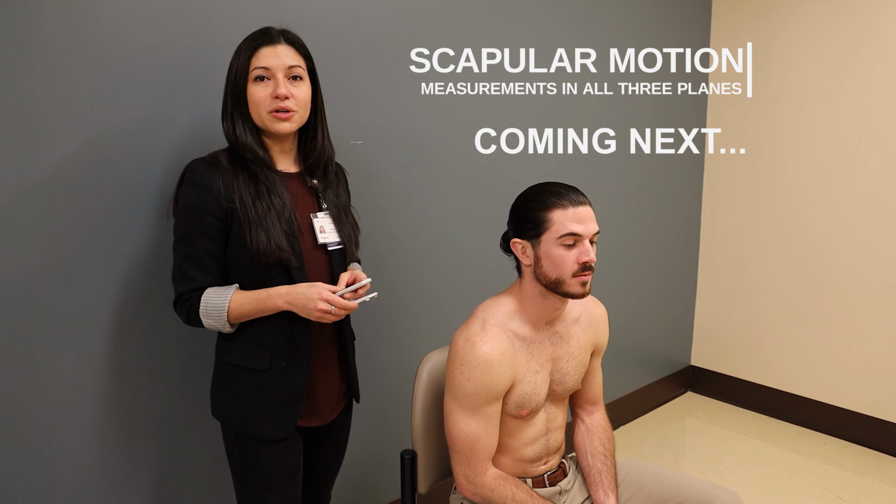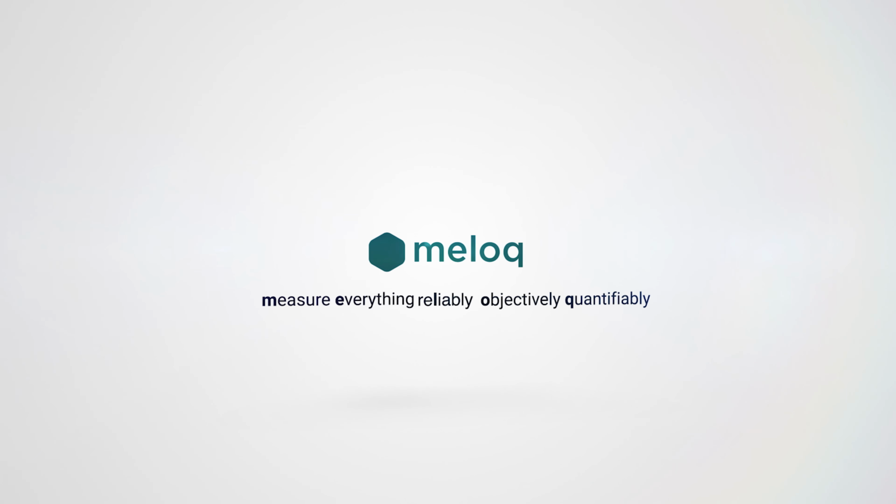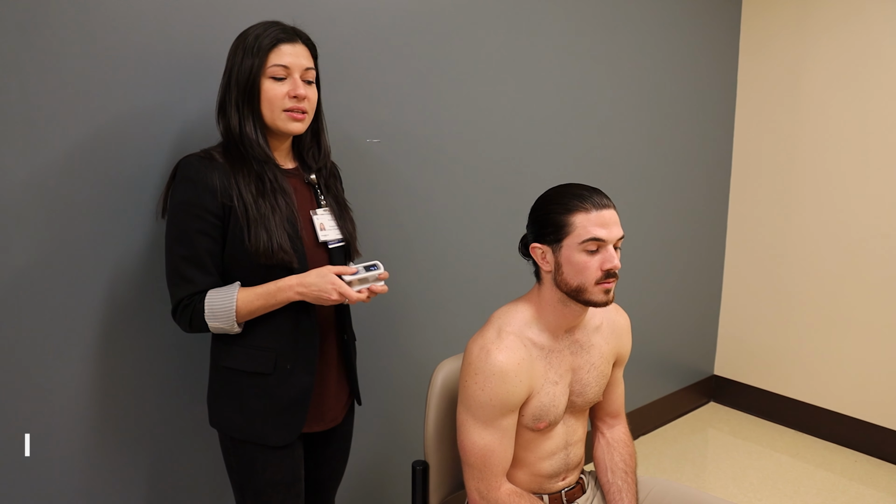So I'll be showing you guys today how to measure scapular motion using the Easyangle. The scapula moves in 3 different planes, the first one being the scapular plane, and that's for upward downward rotation. The second plane is the sagittal plane. That's when the scapula moves into anterior posterior tilt. And the third one is the transverse plane, and that's when the scapula is moving into internal and external rotation.